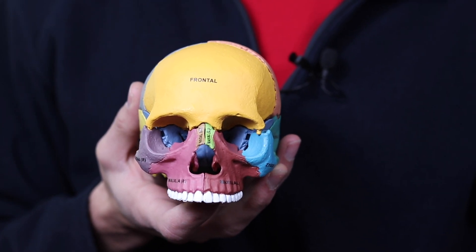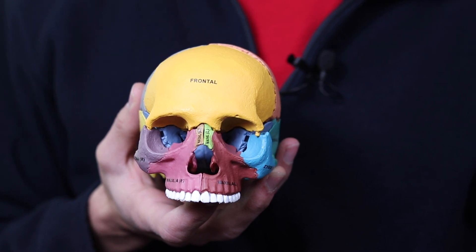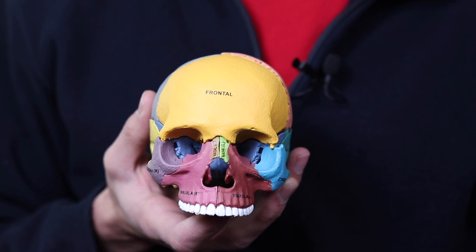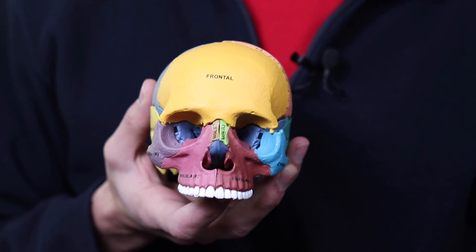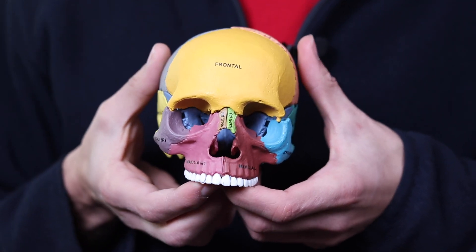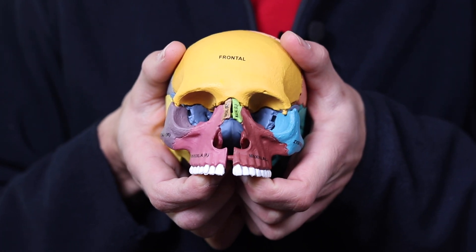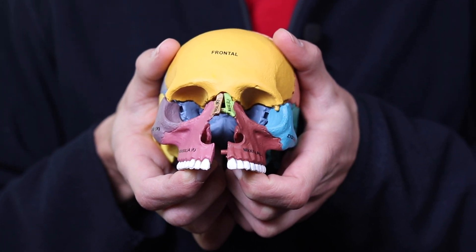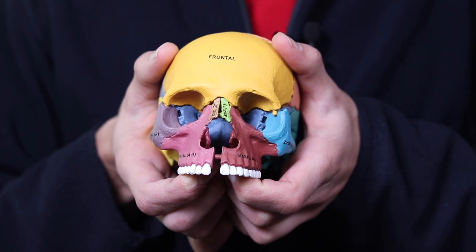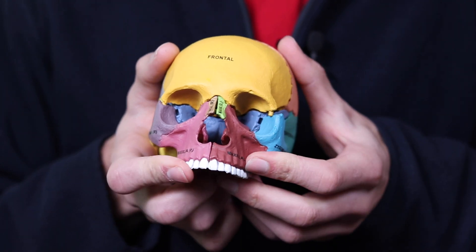The idea here is that the maxilla — the roof of the mouth — is also the floor of the nose. Just like if you're in the basement of a house, the ceiling is also the floor of the level above you. So when we split the suture, keep an eye on the nose. You split the suture and that nasal cavity gets bigger. For the next demonstration, I'm going to pull the maxilla and the cheekbones off of the skull to show you how the roof of the mouth really is the floor of the nose.